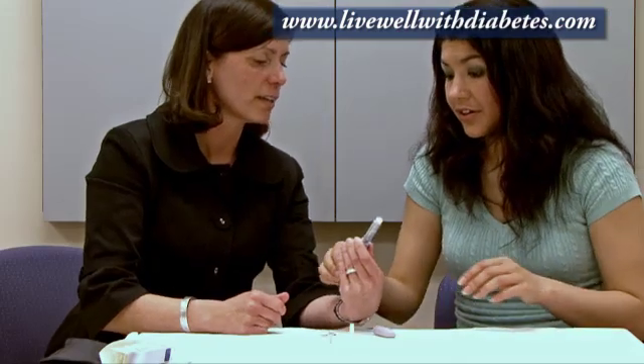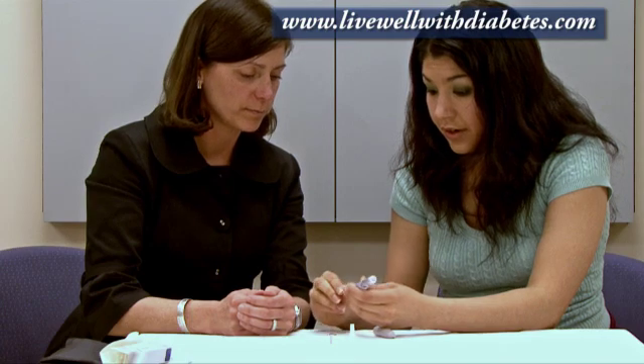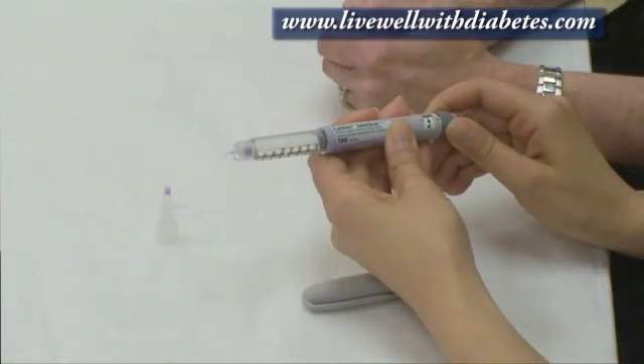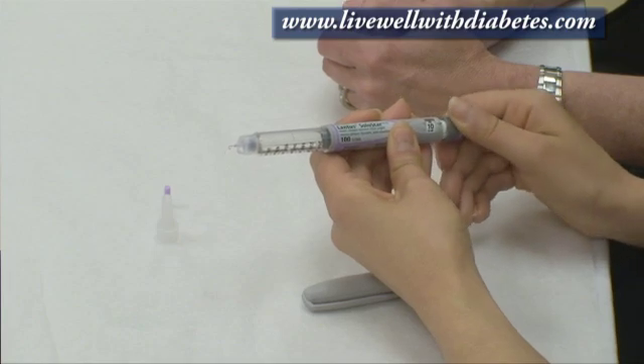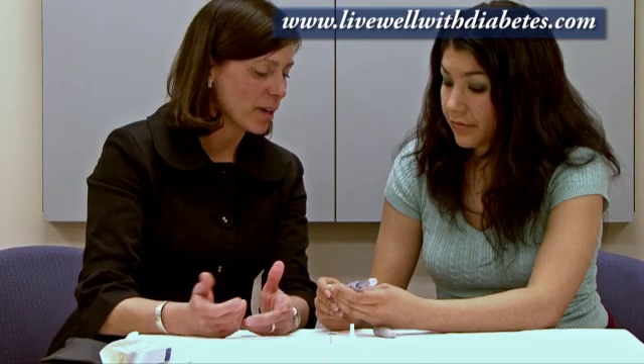Did you want to try that? Sure. So it's at zero — just turn it to one. There we go. Perfect. So depending on your dose of insulin, let's say the doctor suggests ten units, you would just turn that to ten. Perfect. Every time you turn the dial it changes by one unit — you can hear the clicks and feel the clicks. That's all measured and now you're ready to do the injection.